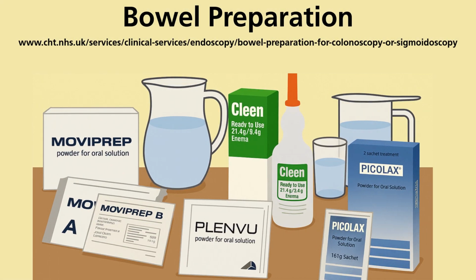To prepare for your procedure, you will need to take bowel preparation to clean out your bowel. This is to ensure that we can clearly see the bowel wall for any abnormality. If you are having a colonoscopy, this will be oral bowel preparation. If you are having a flexible sigmoidoscopy, this will either be an enema or oral bowel preparation. The reason for your procedure will determine which bowel preparation you need. The instructions on how and when to take your bowel preparation will be included with your bowel preparation package.